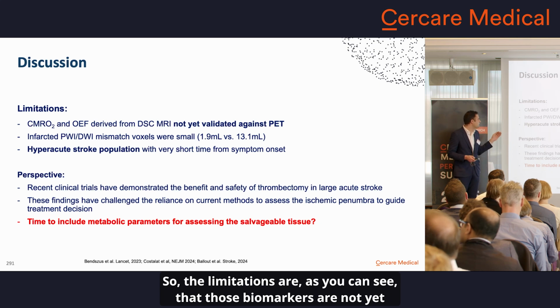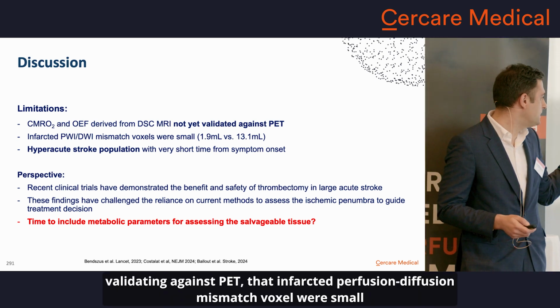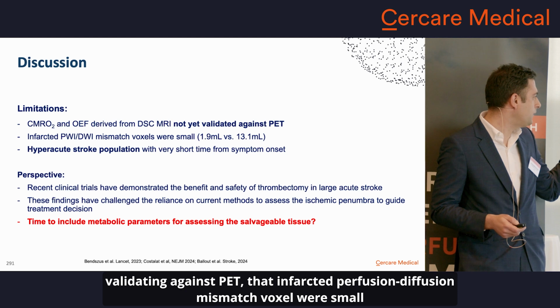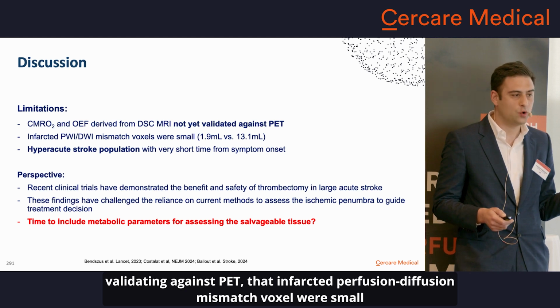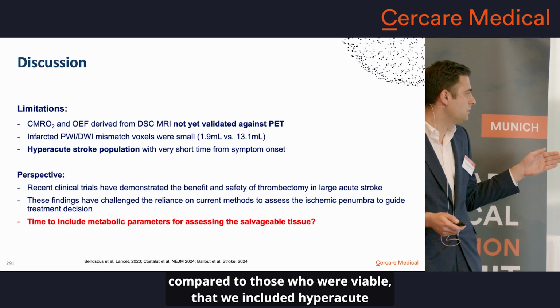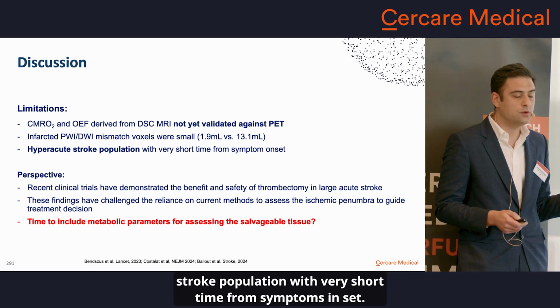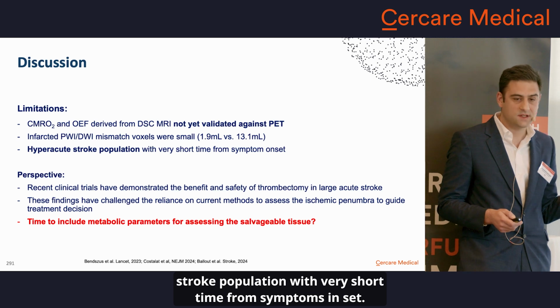So the limitations are, as you can see, that those biomarkers are not yet validated against PET, that infarcted perfusion-diffusion mismatch voxels were small compared to those that were viable, and that we included a hyperacute stroke population with very short time from symptom onset.